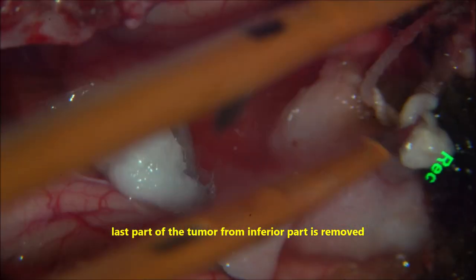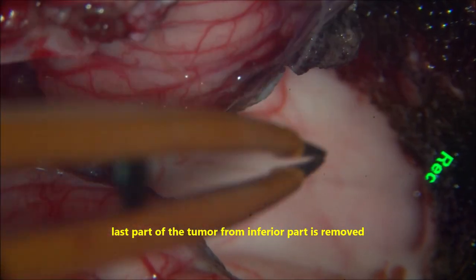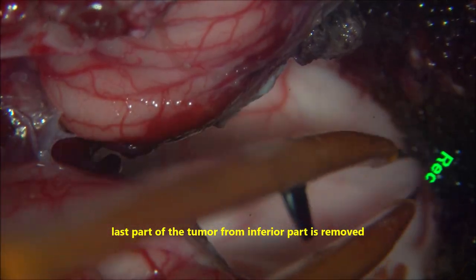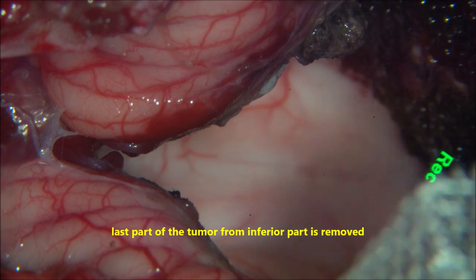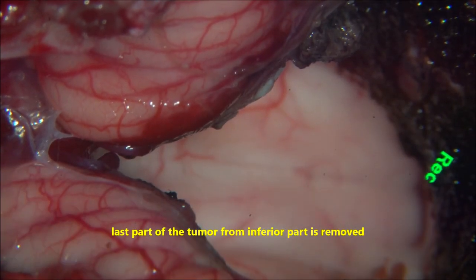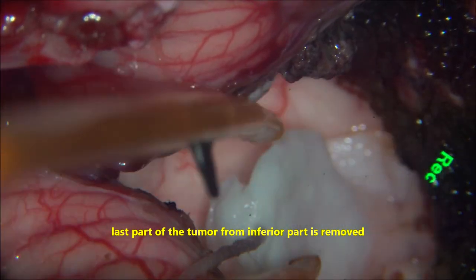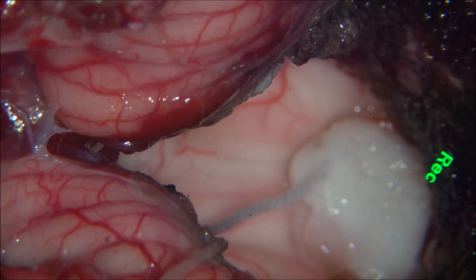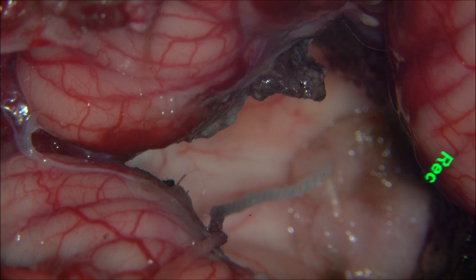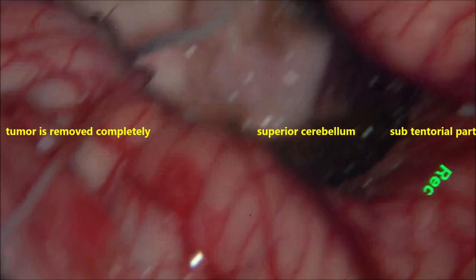The tumour is now completely removed. The floor of the fourth ventricle is visible, and CSF is escaping clearly from the aqueduct with no hemorrhage. The floor of the fourth ventricle is perfectly normal. There is no bleeding from the tumour site or tumour bed. The aqueduct is covered, and at this juncture we increase the blood pressure by 10 to 20 mmHg to check for any ooze from the tumour bed.